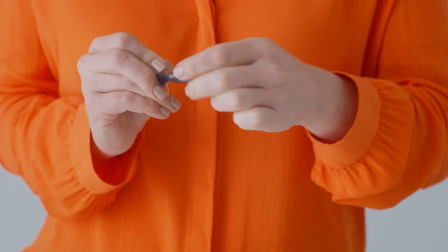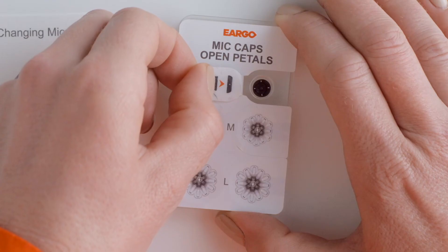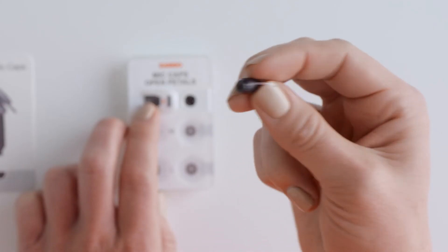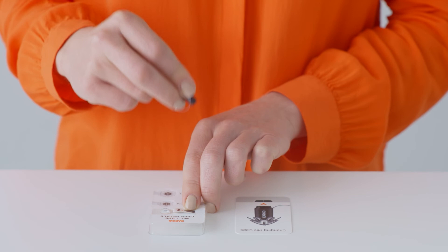Select a new mic cap from the packaging tray and peel the tab up. On the underside of the tab, you'll see a visual guide showing you what to do. Align the sound inlet on your Eargo device with the center of the new mic cap in the tray. Press it into place until you feel a click.